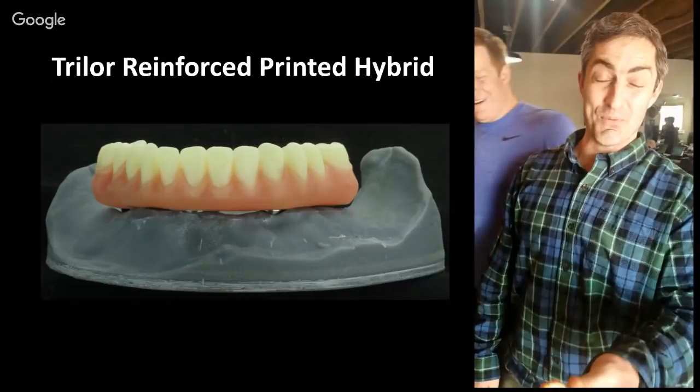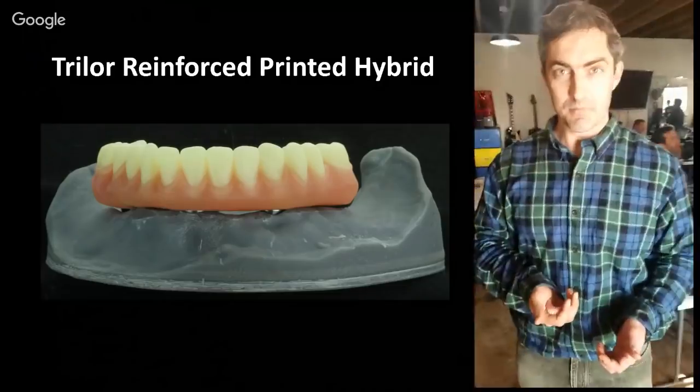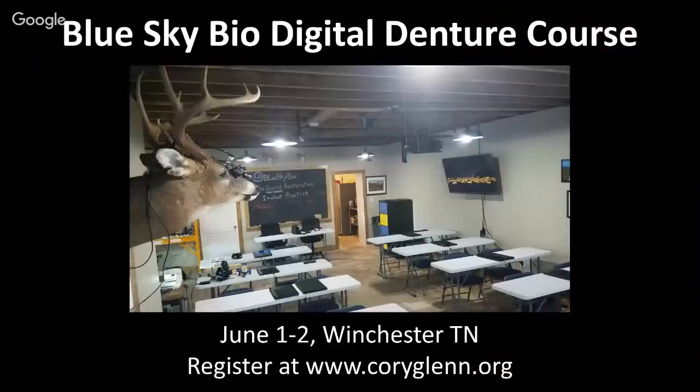And so I think this has possibilities as a definitive long-term restoration, especially if we use that MFH material. As long as the color stability is good, there ain't no way that the patient is going to be able to break this. So I've taken this to my last probably 8 courses, probably 300 plus people. No one has been able to break it to this point, not just Garrett. So I'm not picking on just him. This stuff is indestructible. So it's a really, really cool option. And I'm going to stop at that.